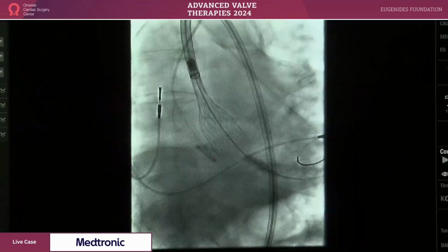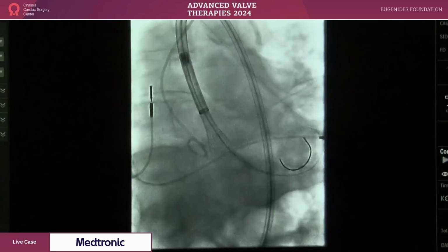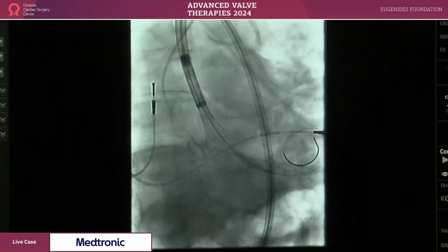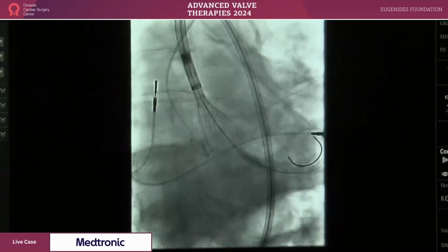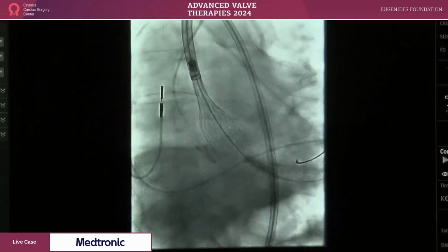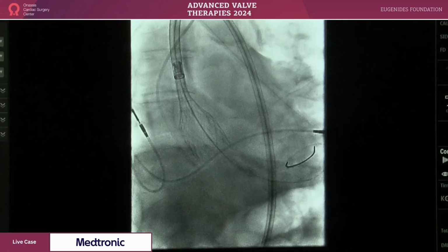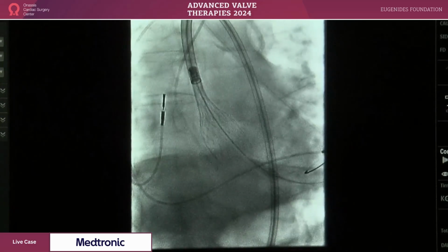So you see, it kind of self-centered a little bit. Maybe we can see how it behaved. So you see, there's not a lot of calcium. It opens quite nice. Well, that's good. You're near zero implant, I think. So we have to check for stability. When I see this bell shape, can you give a small injection so that we can see how? Maybe I'm not very happy with that.